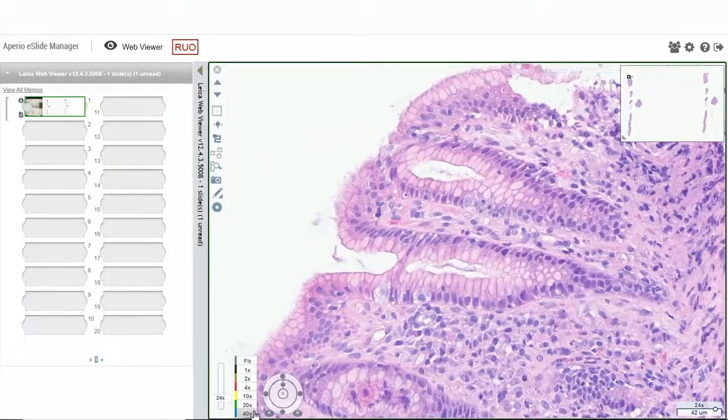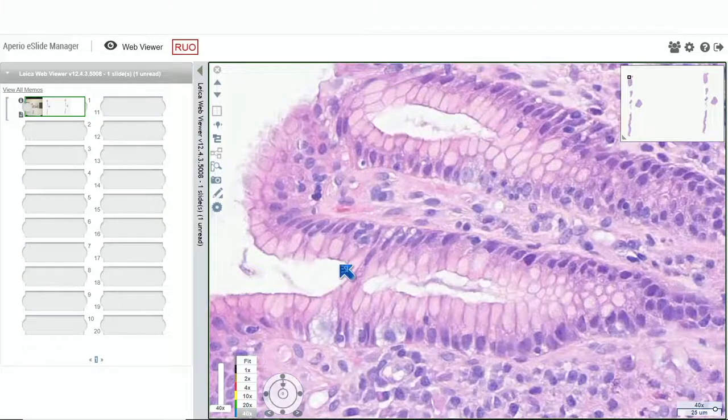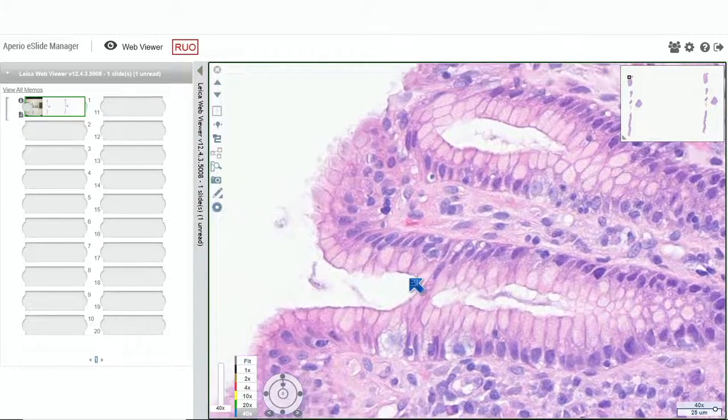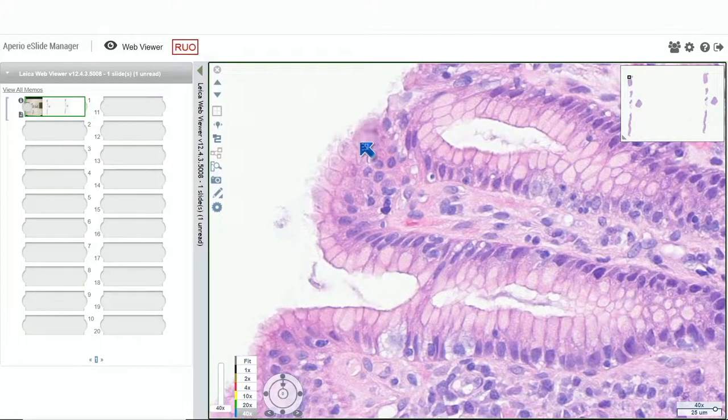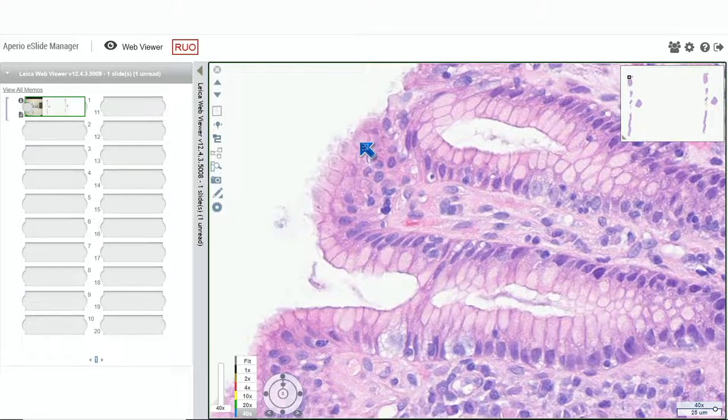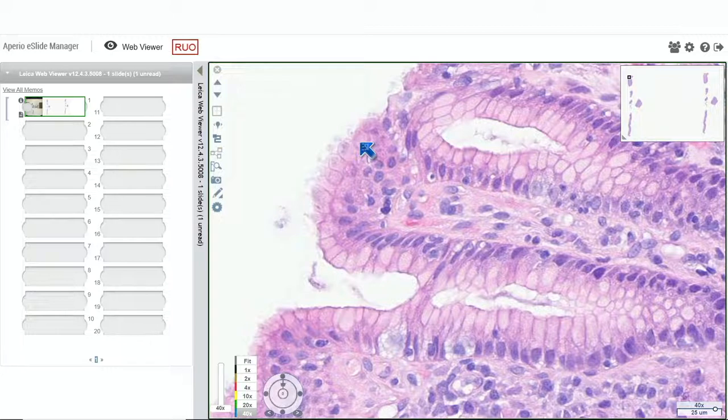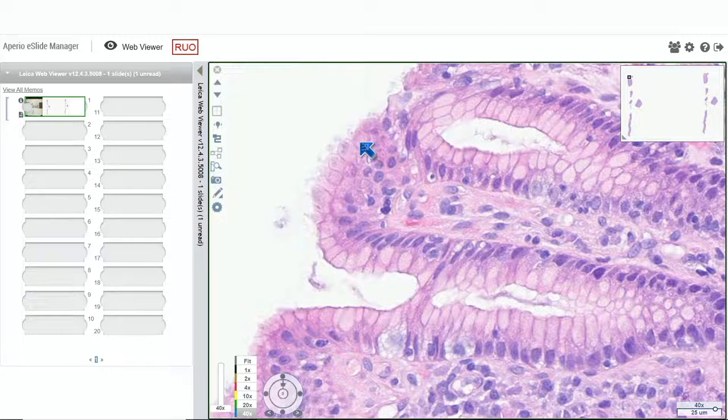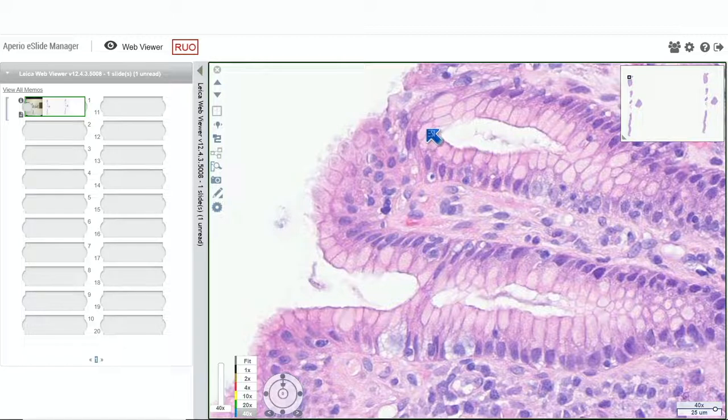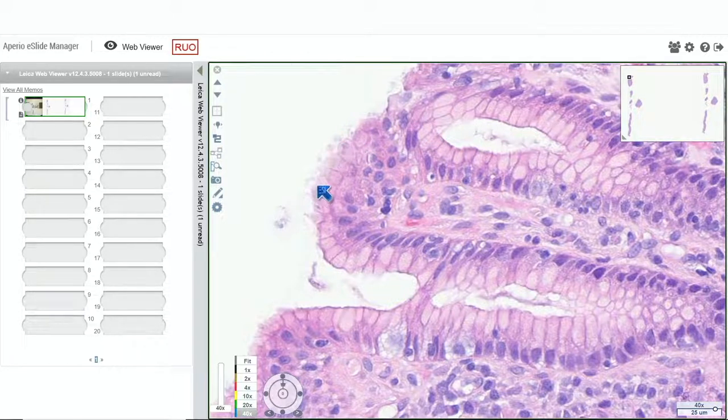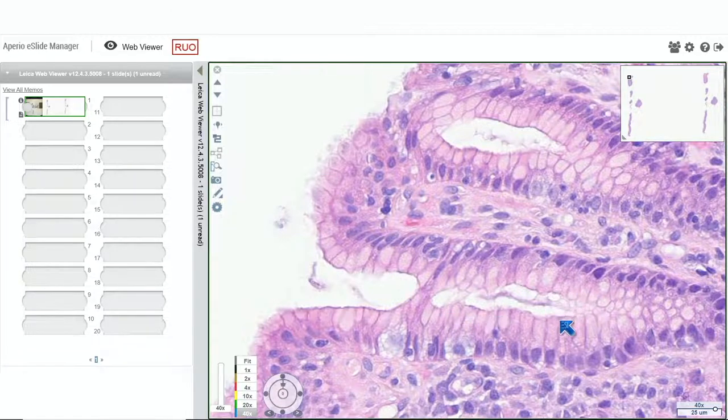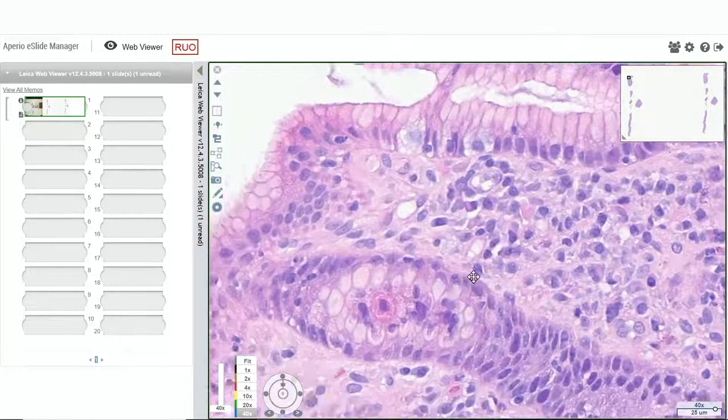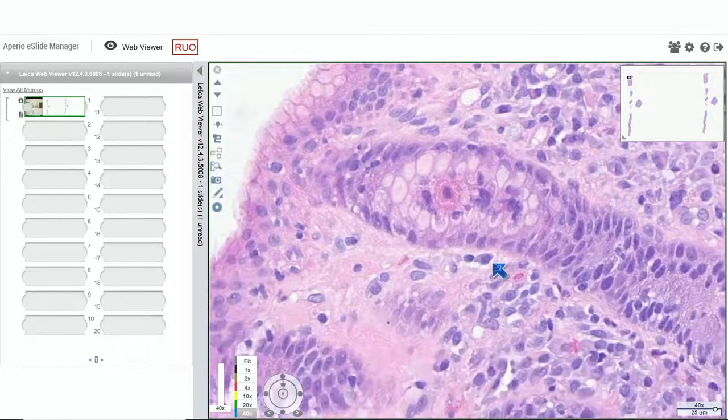Unfortunately, on these scanned slides, we can't really see the organisms. But at low power, intermediate, and high power, the top thing that we should be thinking about with this superficial plasma cell rich inflammatory infiltrate in the antrum is H. pylori-associated gastritis. In fact, there are several organisms. I think this is one over here. There are a few down here. They're just not well visualized in the scanned slide.